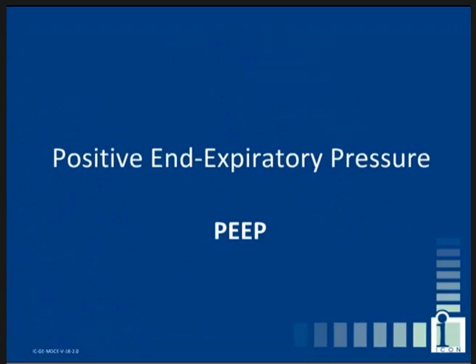Positive end expiratory pressure, or PEEP, is essential in the management of respiratory care in critically ill patients requiring ventilatory support. PEEP elevates the baseline end expiratory pressure and maintains recruitment during the expiratory phase, where de-recruitment predominantly occurs. The ideal PEEP setting and its effect in animal models with acute lung injury and patients with acute respiratory failure have been widely studied over the past 3 decades and has produced a vast amount of information.